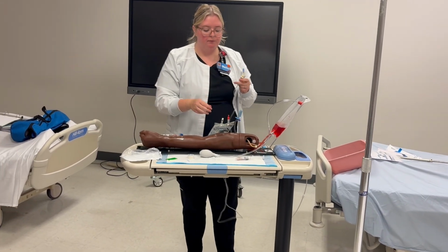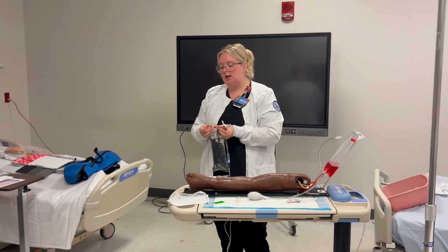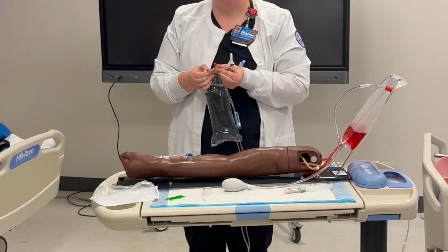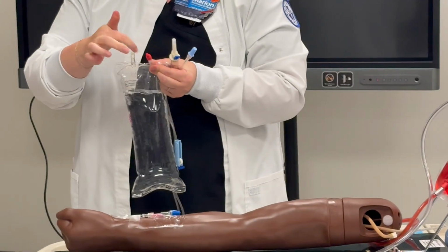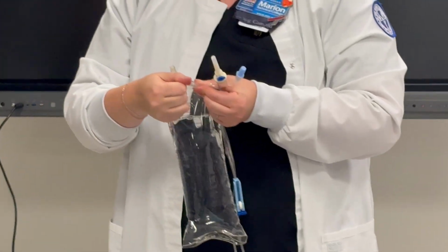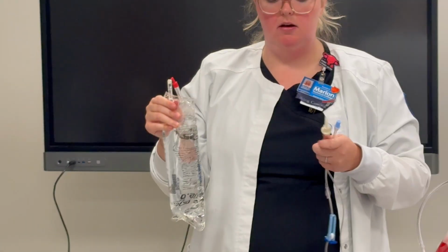Okay, so when we go to spike, there's two ends. This end is like the top of a stopper to add medication to this bag if the pharmacist needed to add medication. We're gonna spike into this part. You can't get this off. This is really hard to get off. This comes off easily. So I turn my bag upside down.